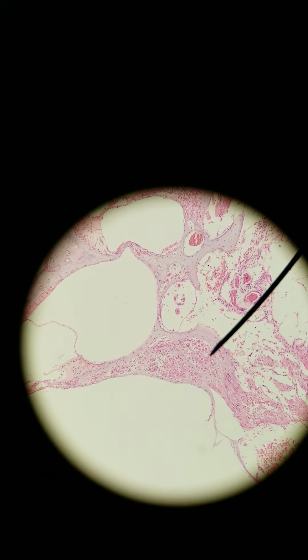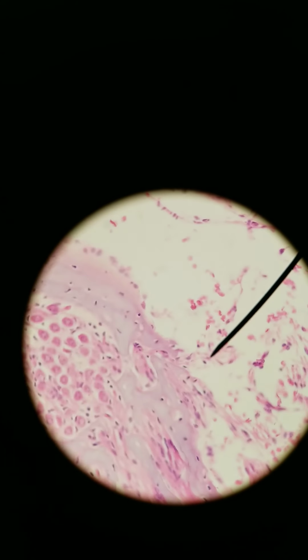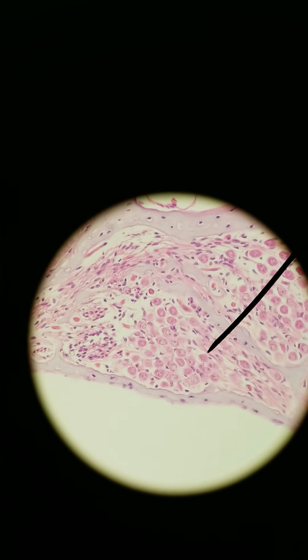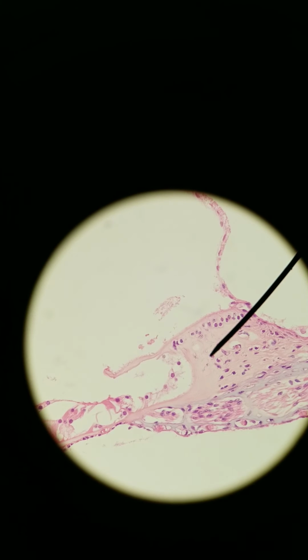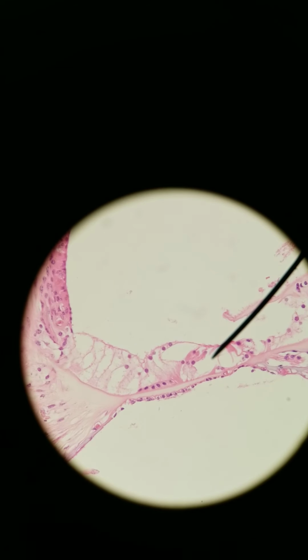You can see cell bodies here. These are the cell bodies of the sensory neurons. So this is a ganglion. This is a cochlear ganglion of these bipolar cells. So yeah, here's a ganglion, sensory neurons. The sensory neurons receive input from these hair cells. So I'll trace this one more time.